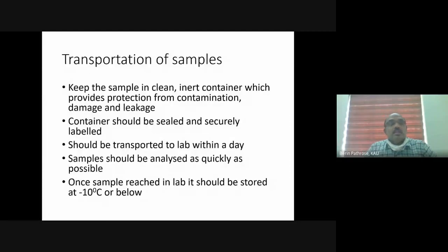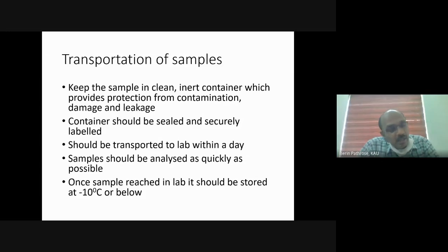So, dear students, yesterday we completed up to sampling. In the steps of pesticide residue analysis, we discussed experimentation. Experimentation is not a usual step in pesticide residue analysis. Usually, the first step is sampling, and the next part of sampling, though it's not a step.